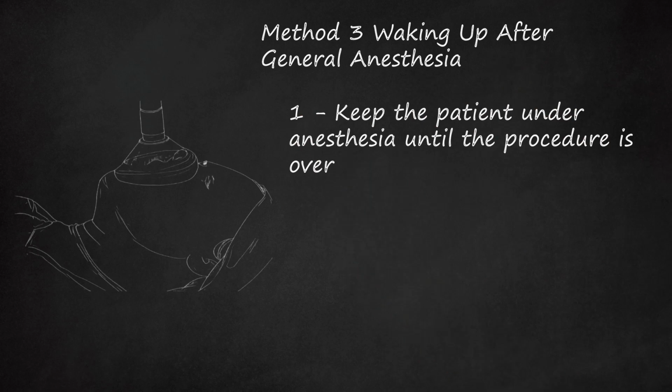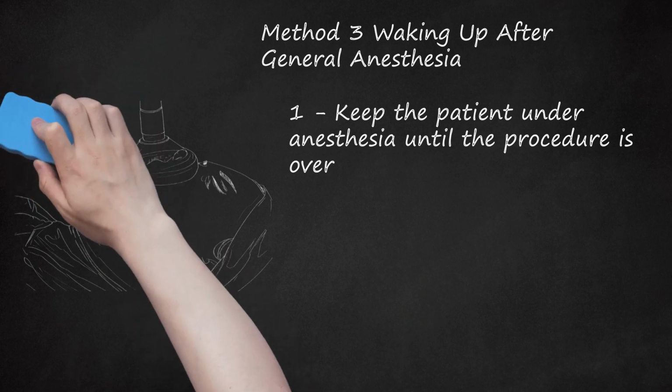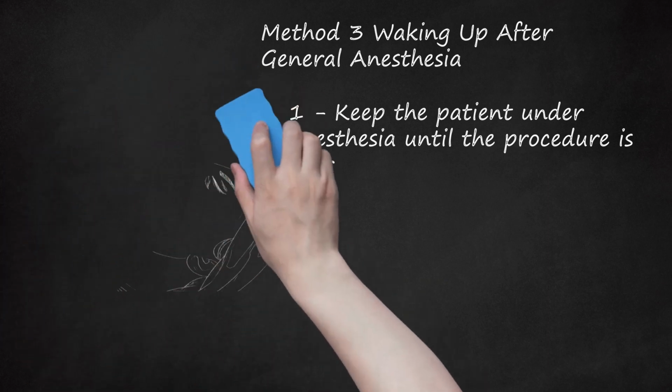The patient will continue to receive medication to stay sedated until the surgeon has completed his or her procedure. After the procedure is complete, the anesthesiologist will reduce the use of the medication. Before removing the endotracheal tube, the anesthesiologist will ensure that the patient is breathing adequately without assistance, has stable vital signs, has had appropriate medications and reversal agents if necessary, can follow basic commands and demonstrate good muscle strength, usually by lifting his or her head or squeezing somebody's hands.